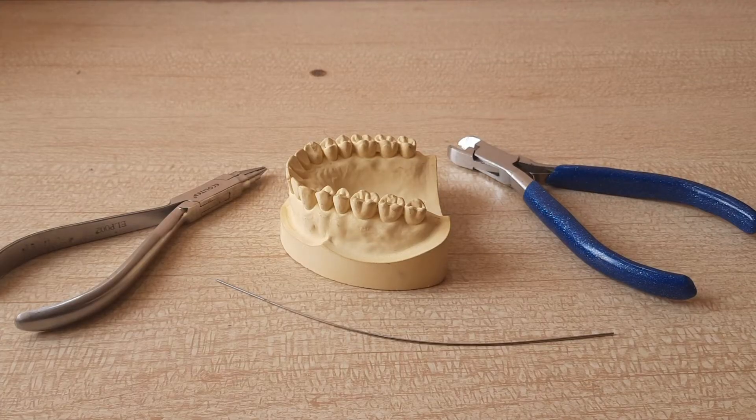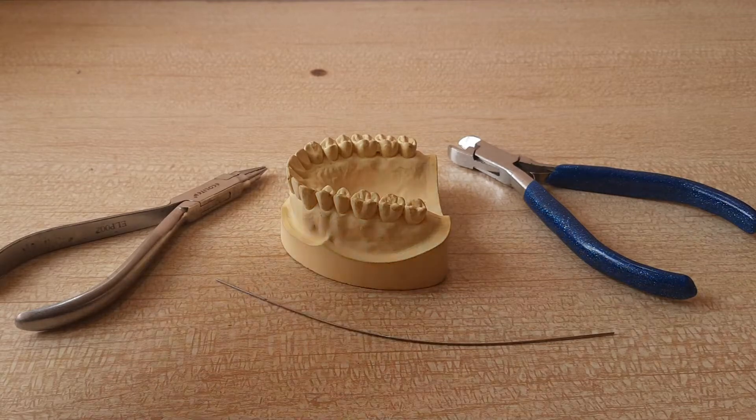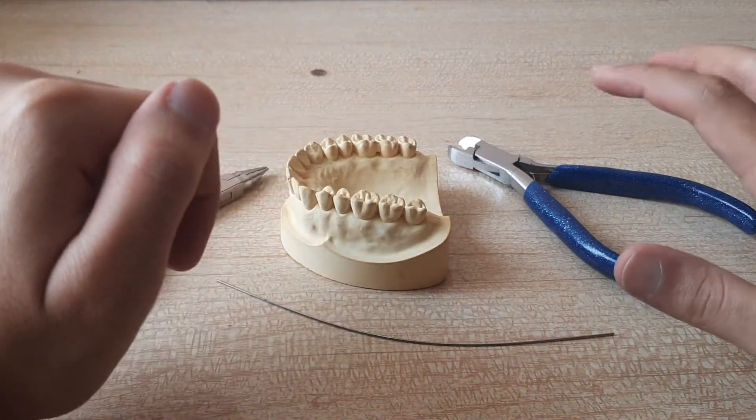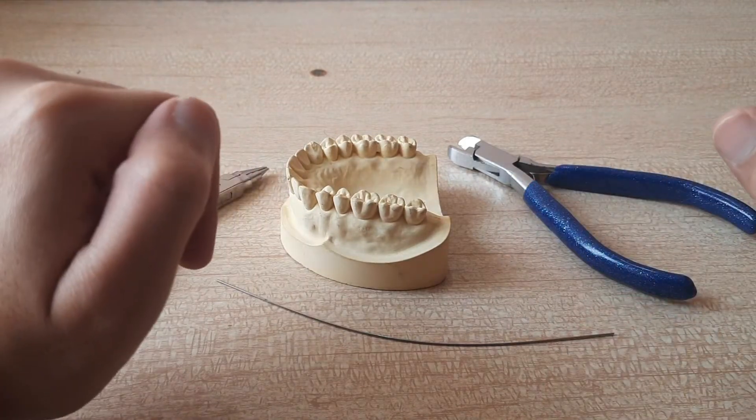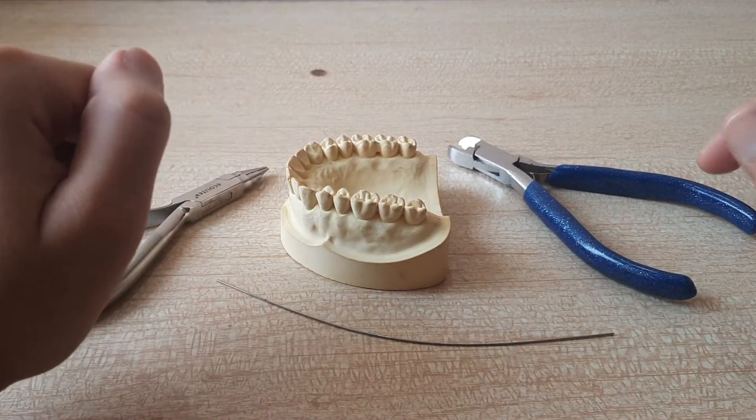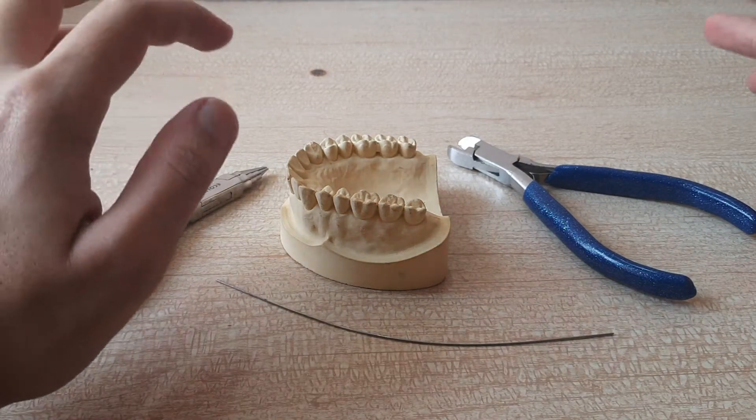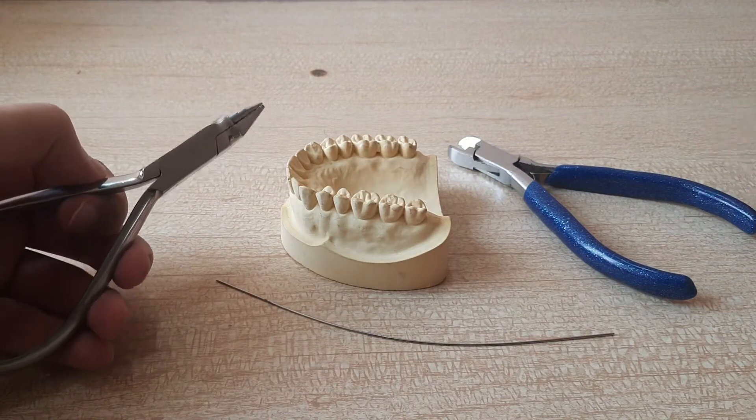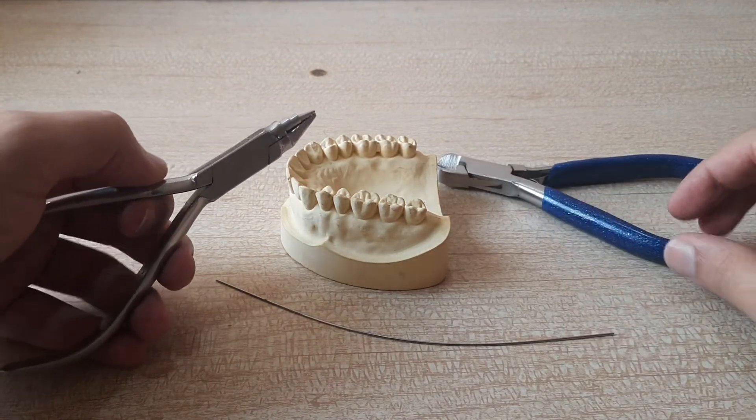So let's start with the making of an Adam's clasp. The things which you need are universal plier, a cast, a cutter and the wire. Now a few people also use the Adam's plier but I don't feel that there is much requirement of an Adam's plier. You can use the universal plier itself and you can make a decent Adam's clasp with that.